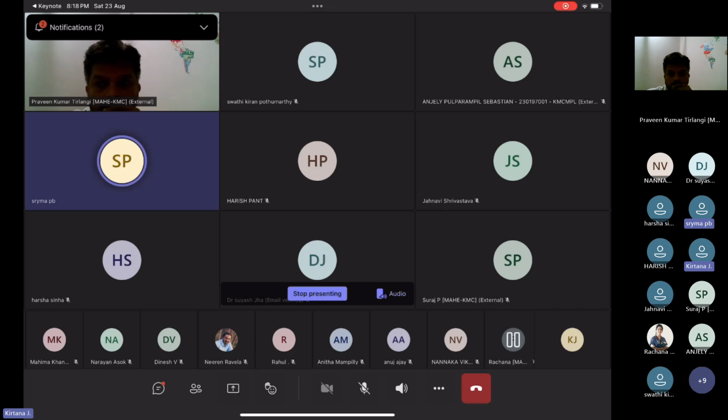So if you're increasing your PEEP and bring down the tidal volume, you can still keep the driving pressure. You can manipulate it. If you change two variables, then it will change anyway. And there is day-to-day variation in all these things, so a single method may not be correct all the time. Recruitment inflation ratio is useful and can be done.